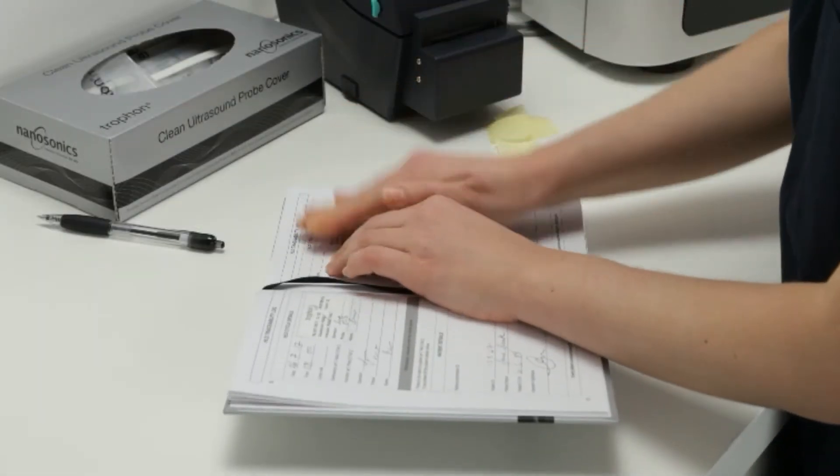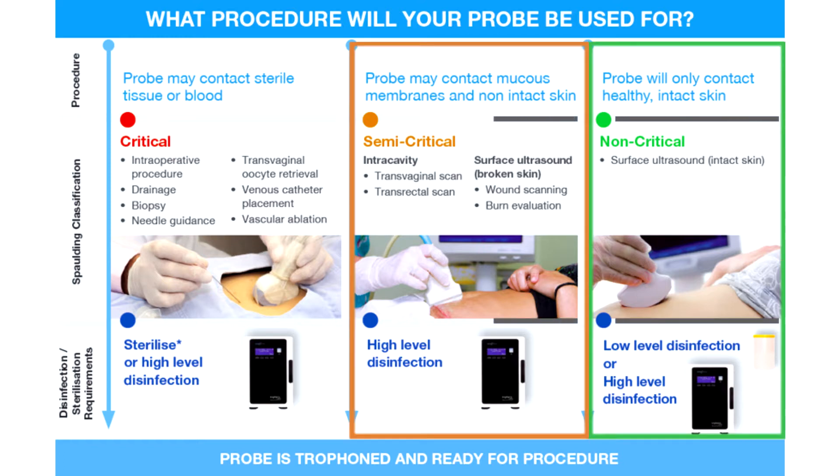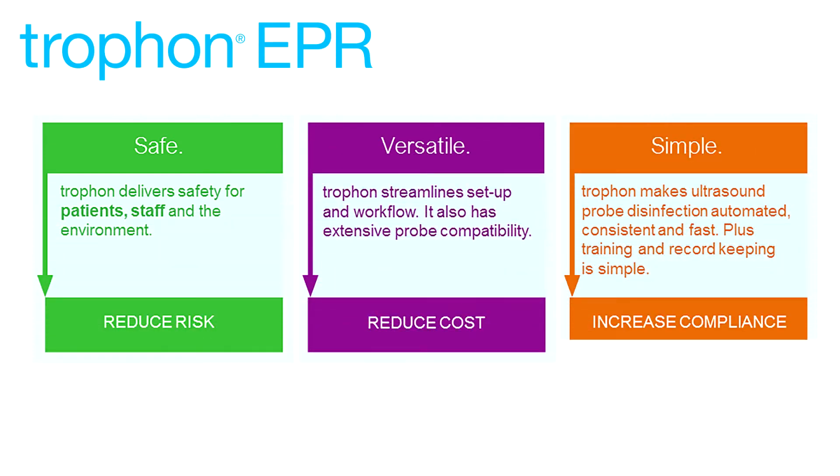Attach the corresponding TROPHON printed label into the TROPHON logbook for record keeping. The ultrasound probe is TROPHON'd and ready for the next procedure. Refer to this diagram in the TROPHON EPR operational training guide to know when to high-level disinfect your probe: Non-critical, Semicritical, Critical. TROPHON is the safe, versatile, and simple way to prevent ultrasound probe cross-infection risk.